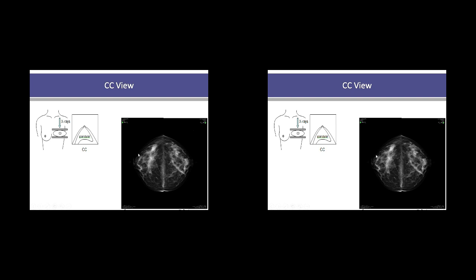So they follow that glandular tissue distribution within the central portion, and then as we come out to the skin edge, the peripheral region tends to be a little more fatty. And what you see as well is that the pattern within the breast is often fairly symmetrical. Obviously not a mirror image, but you tend to see similar distributions of glandular and fatty tissue. If you were to see a bright area here and not here, or a spiky area here and not here, that asymmetry can be used to guide the radiologist to point out that something might be a little suspicious.